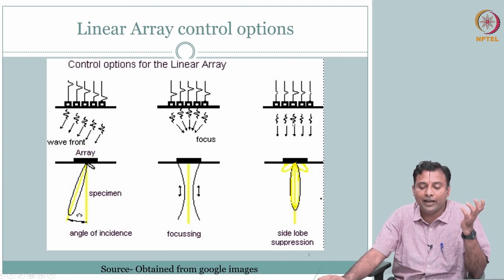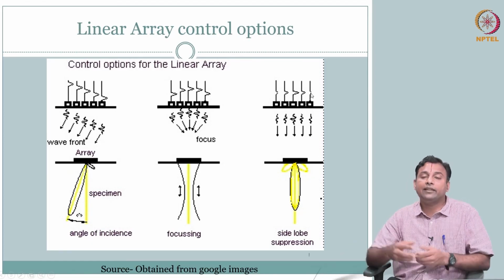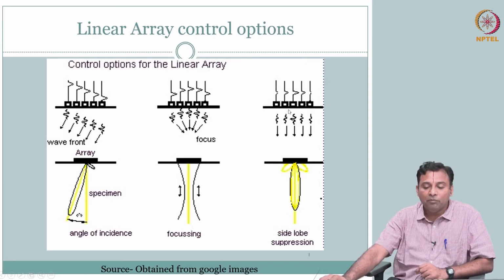When you apply the voltage, I can give more weightage to the center, and as you go to the sides, I can reduce it. So I can have an apodization function and give the amplitudes at transmit itself: a higher amplitude at the center and a lower contribution at the sides. In transmit apodization you can excite the way you want, try Hamming, Hanning, whatever you want. There is no fixed apodization material, because I have control over all the crystals separately, independently.